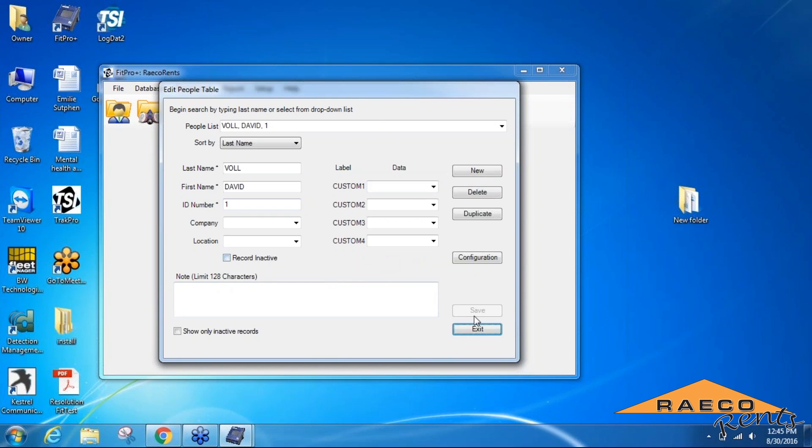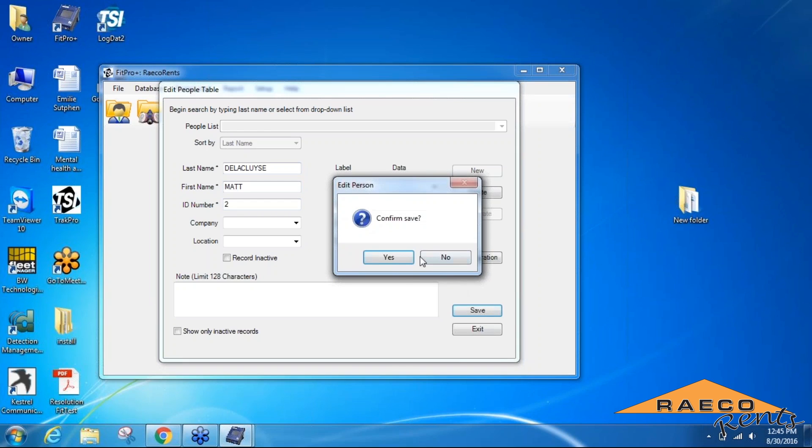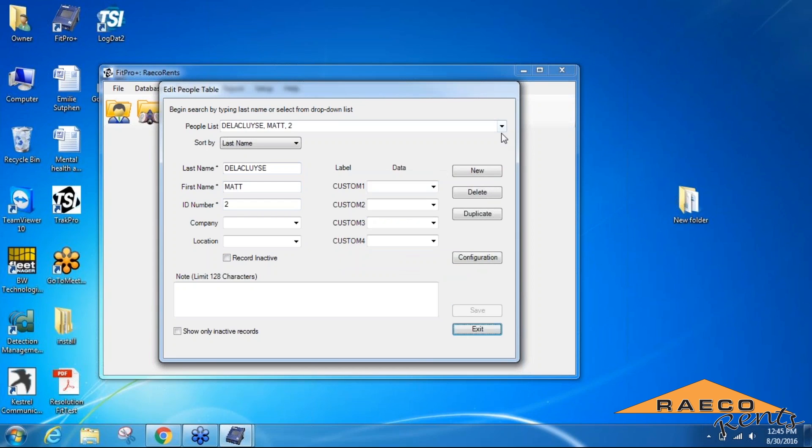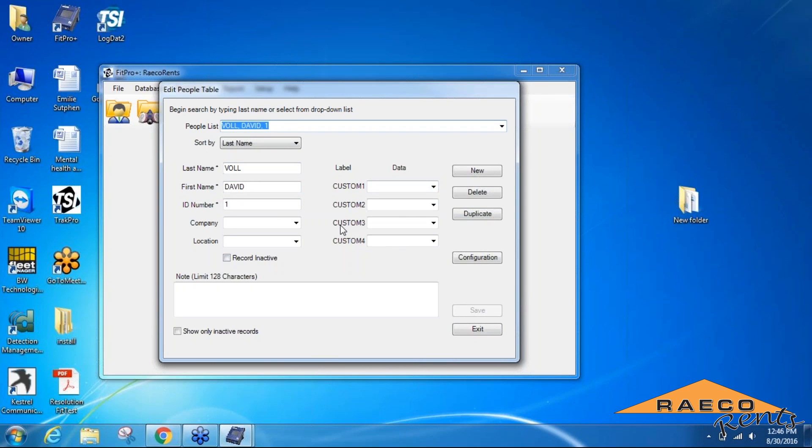If you need to add in more people, you can go ahead and hit the new button again, and we will add in another person and save them in as well. You can verify that these people are being saved by opening your people list at the top. You can add in any of the other fields that are available to you if you feel that you need to. Once we have all of the people set up that we need, we'll add in the respirators that they're going to be using.